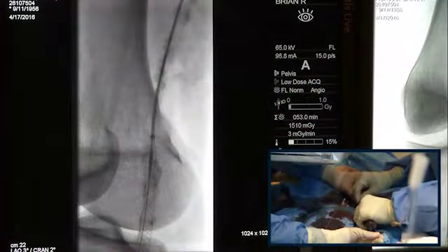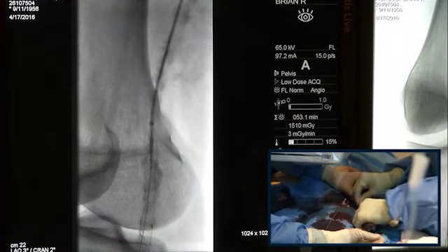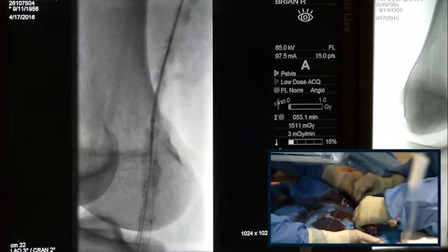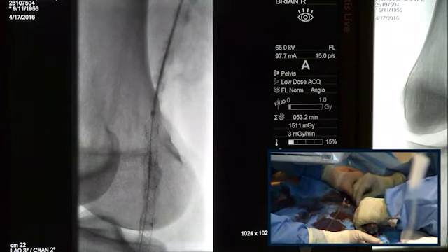Again, the things to keep in mind here, as Andres said, is that you don't want the stent to coil. You don't want the wire to come back. You want to take your time. There's no rush to do it quickly. So you've got to bring your mentality out of the nitinol stents. So you see, like right there, you see that? So that was a little bit of, I caused that.